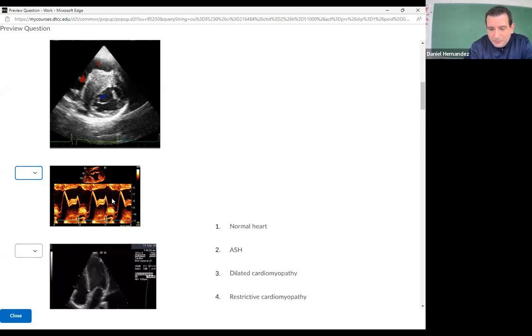So with SAM, the leaflets are being pulled towards the septum. In prolapse, they're going away from that septum. So it's bowing back. So this would be also things associated with mitral valve prolapse, that mid-systolic click. So if you could see the valves together, and all of a sudden you get that click and it bows back. So around mid to late systole. So in this case, it's a little bit later, but again, around mid systole, you get that click and that leaflet bowing back.